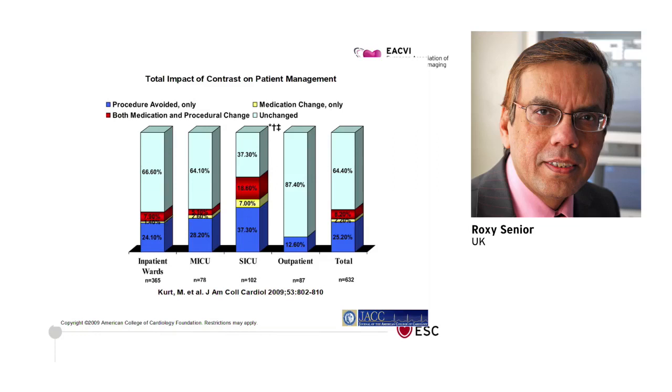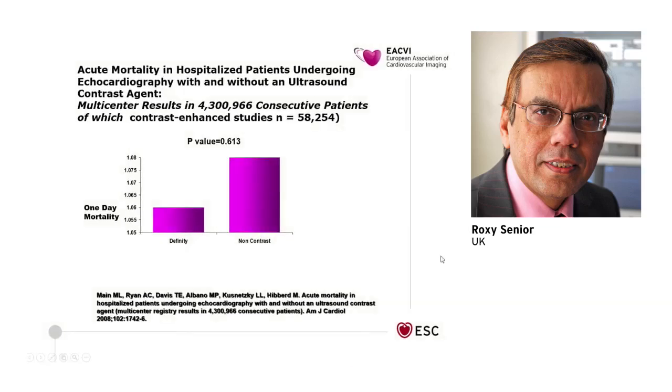And in the surgical intensive care unit, it's about 60%. So quite a high percentage of patients actually benefited from contrast echocardiography in this prospective analysis. So if we now move on to see whether contrast echo is actually safe in this population.